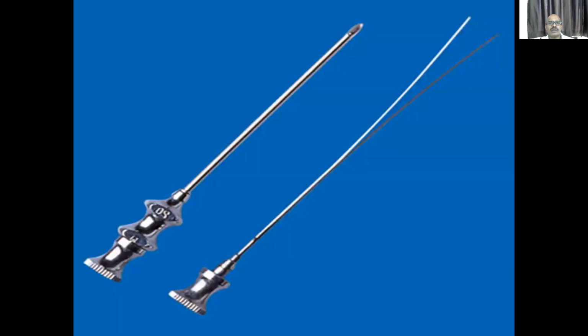So coming to the liver biopsy. Here you can see the liver biopsy needle very clearly. The needle is bifid. Here this is a stylet, and this is the needle which is bifid.